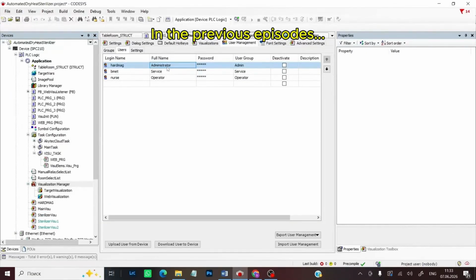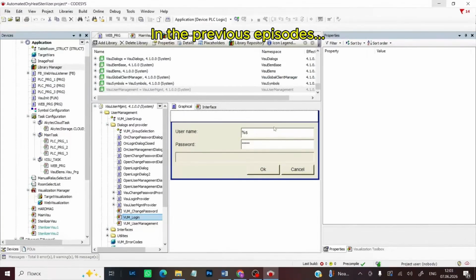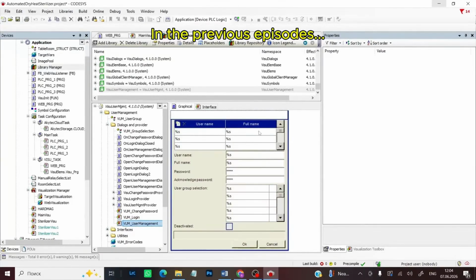The first user has administrator rights, meaning they will manage user access rights to the visualization components of the control system. The second user will have maintenance rights for the entire control system, meaning they will be responsible for ensuring its proper operation. And the third user will have sterilizer user rights, meaning they will be responsible for sterilizing medical instruments. And when you press this button, the corresponding window from the Visu User Management Library will pop up. For example, the authorization visualization or the user management visualization.